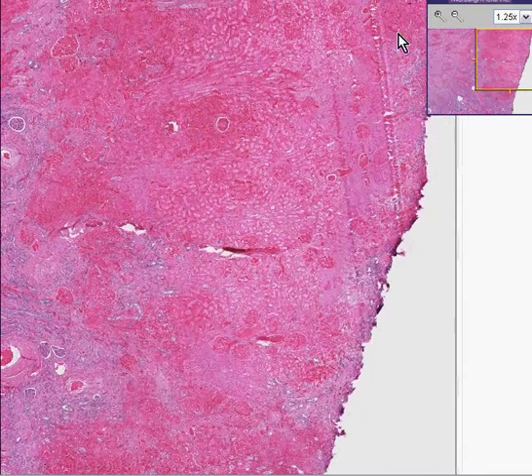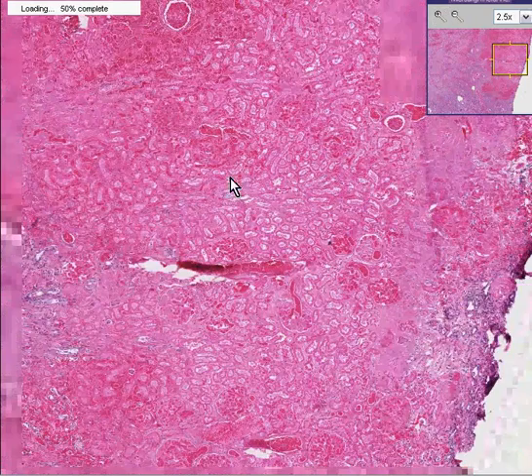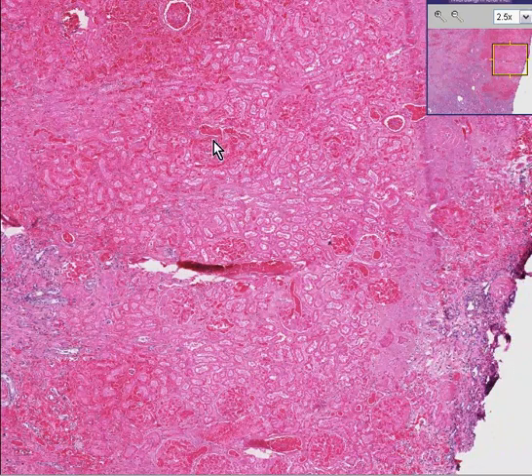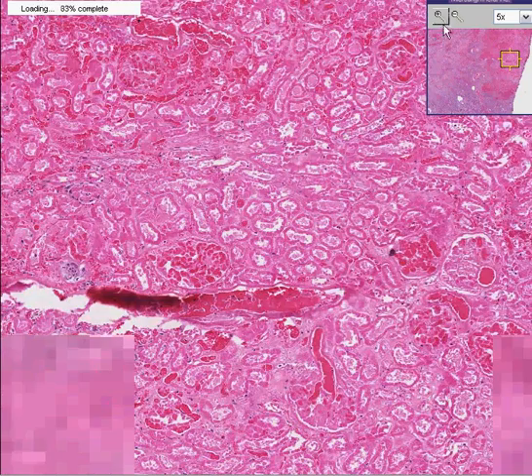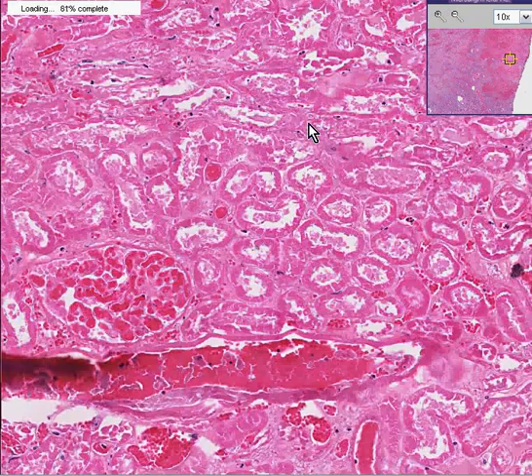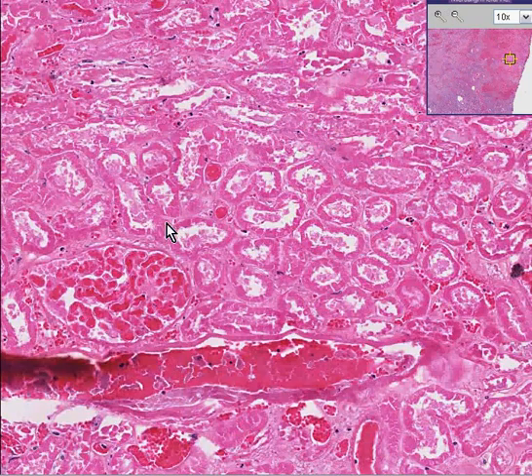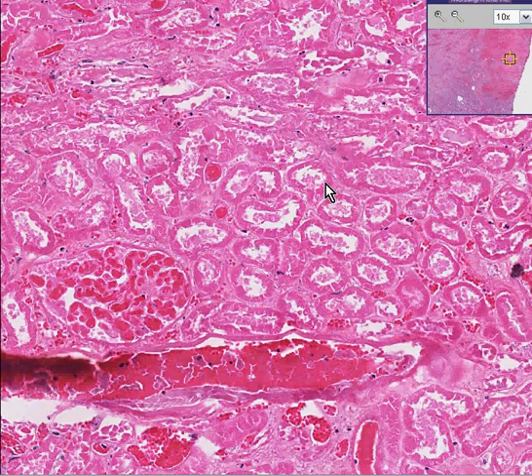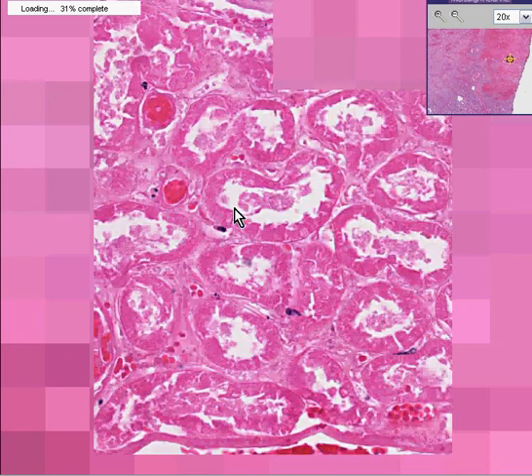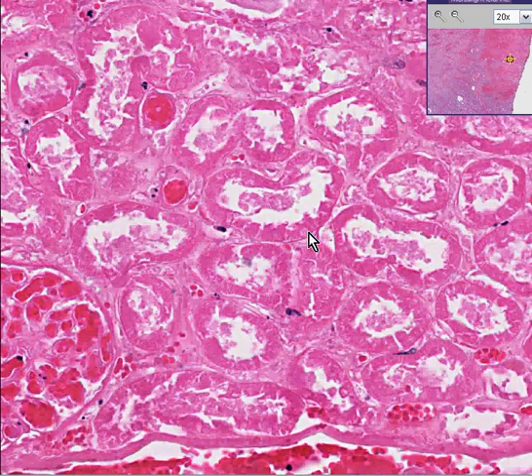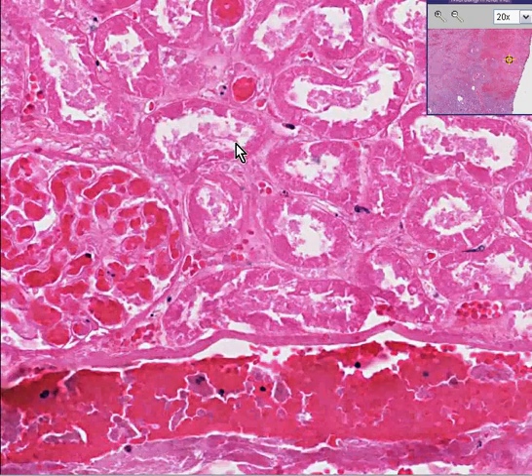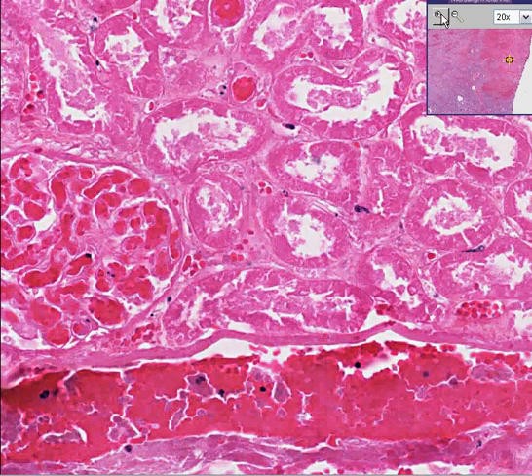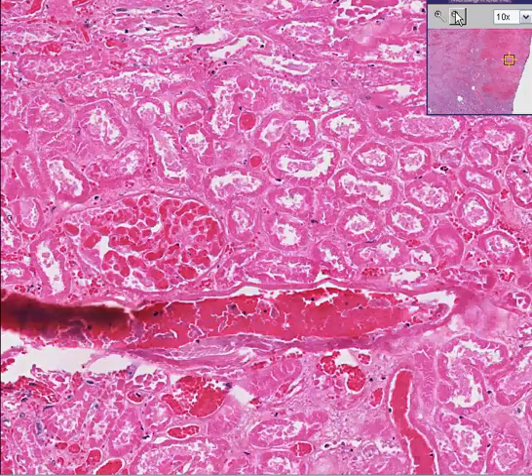This is very classical for an infarct. You can still see the outlines of some of the glomeruli within this infarct. But more importantly, you can see that there is no cellular detail within most of the tissue structures here. You can see glomeruli and tubules, but you can't recognize nuclear cytoplasmic differentiation because this area is dead. So we have an infarct in the kidney.